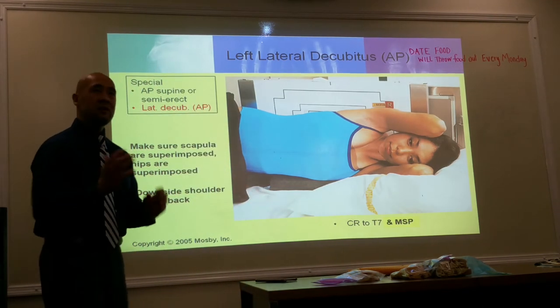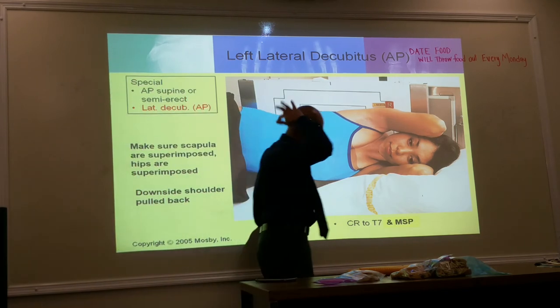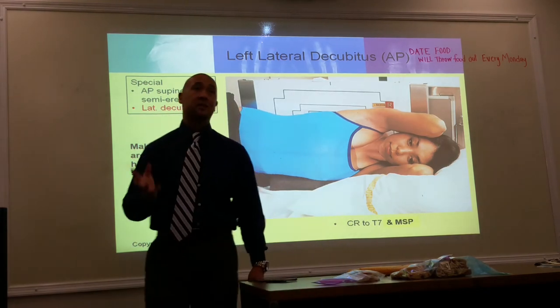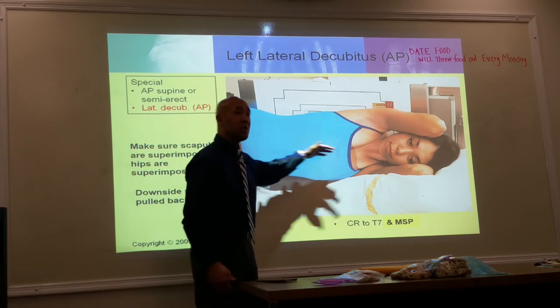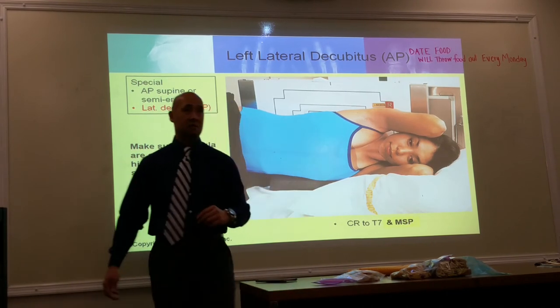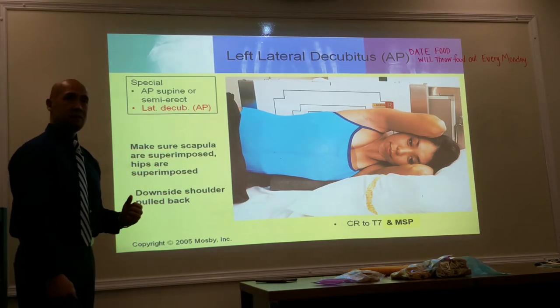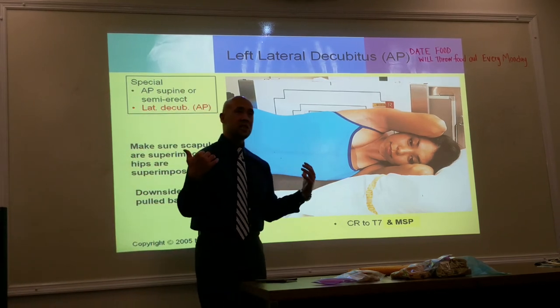Okay? Criteria doesn't change. I'm going to place the top of my image receptor at the level of the vertebral prominence, C7. And then I will match my central ray accordingly to my image receptor at the level of T7. Everybody understand that?